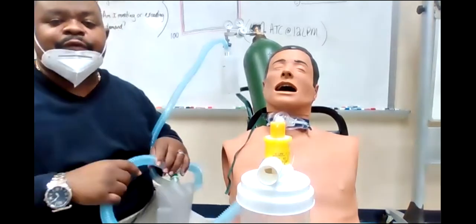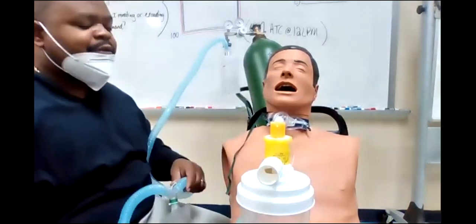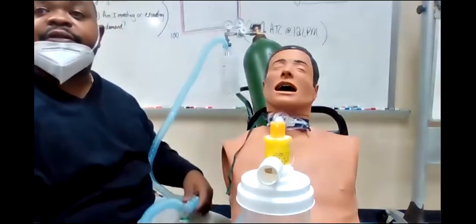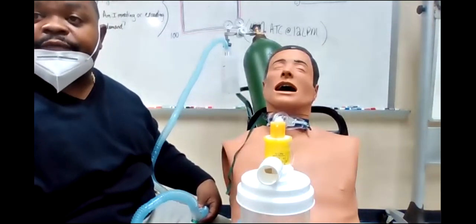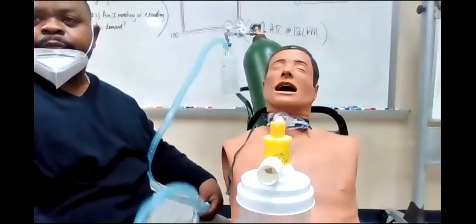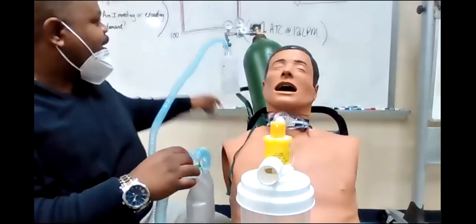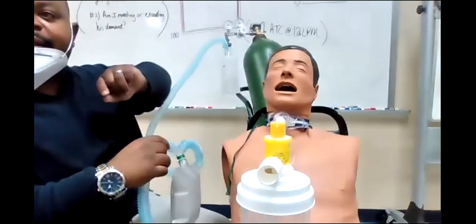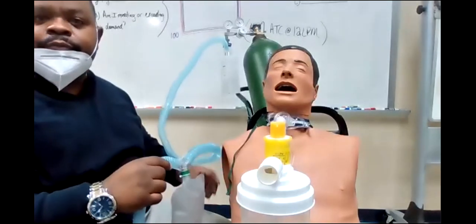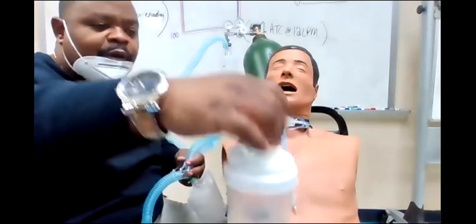We're going to learn more about it tomorrow. But when you have your lab, I'm going to say, put Mr. Smith on an aerosol trach collar of 35% running at 10 liters per minute and then tell me the total flow. So you're going to go hook it up just like I just did, turn it on, and then go to the board and write down the total flow. You got it. That's it on that part.